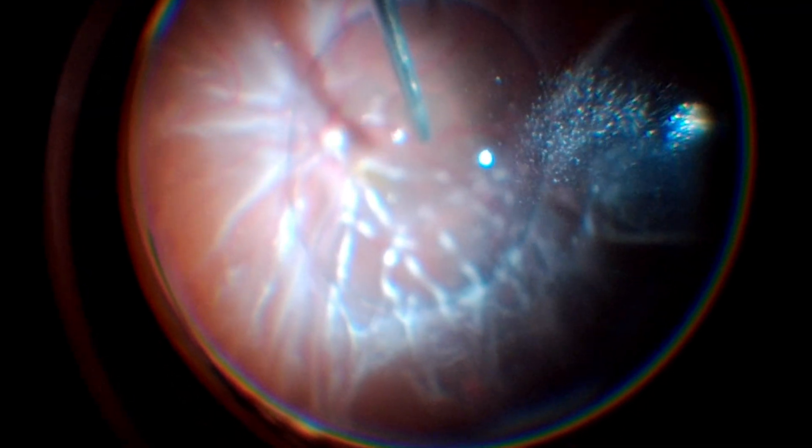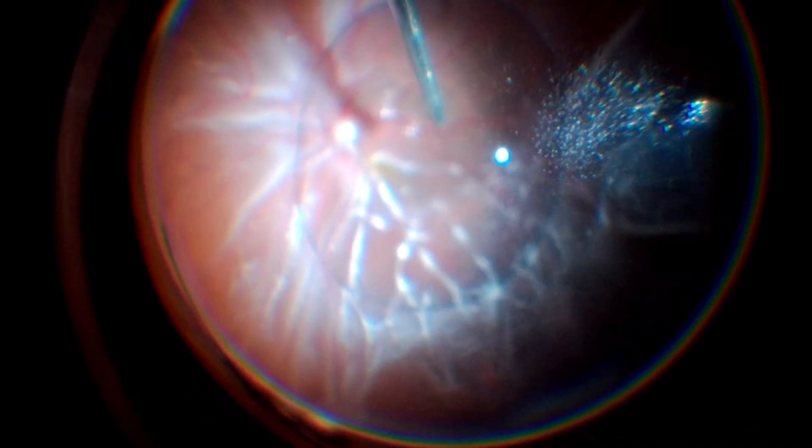Perfluorocarbon is then injected until it reaches just below the level of the primary break, and a 360-degree retinectomy is performed.